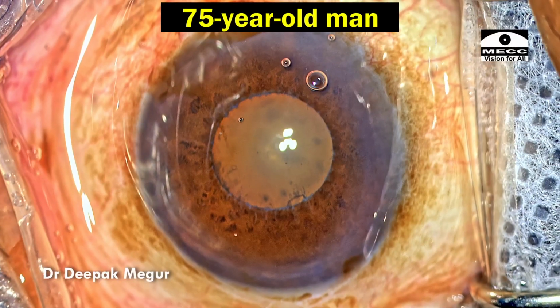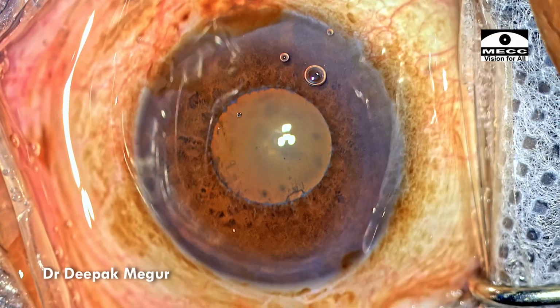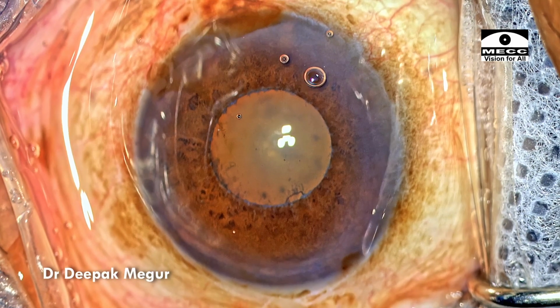So he is a 75-year-old gentleman who wants cataract surgery in this eye, and at the time of examination, the pupil is moderately dilating. This is the maximum dilatation which we can achieve. There is a very subtle evidence of phacodonesis.